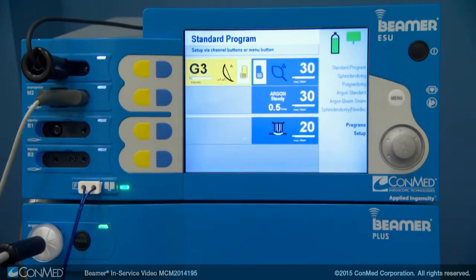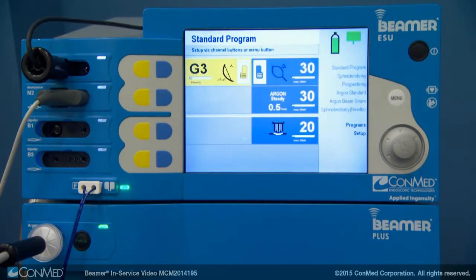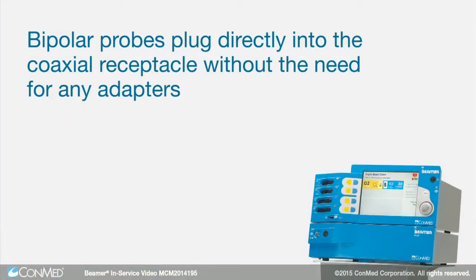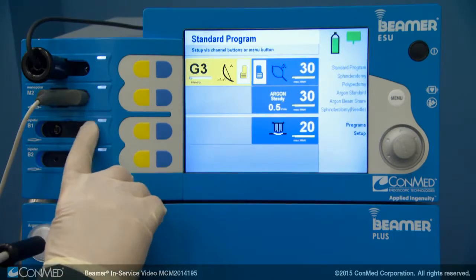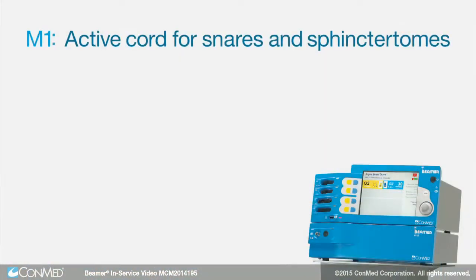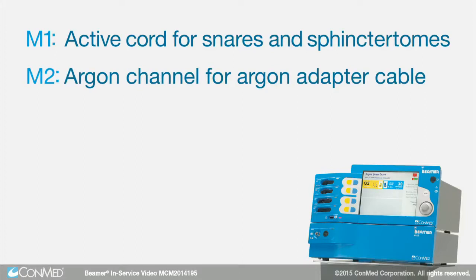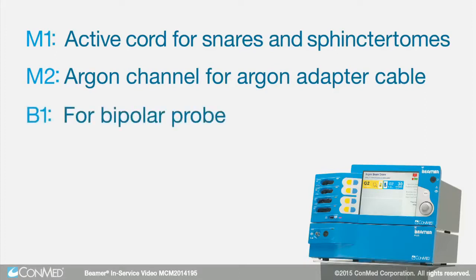The third line down is labeled bipolar B1 and is used for bipolar probes such as a BICAP or gold probe. These devices plug directly into the coaxial receptacle on the left without the need for any adapters. You will almost always have your active cord for snares and sphincterotomes plugged into M1. The second monopolar input will be designated as the argon channel. The third input, bipolar B1, will always be used when using a bipolar probe.